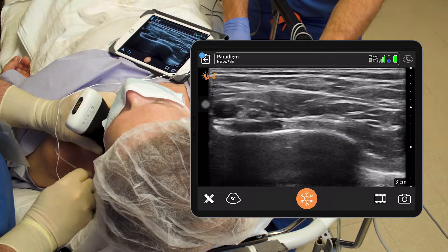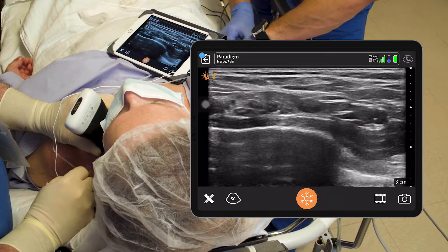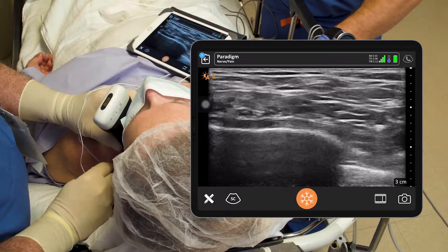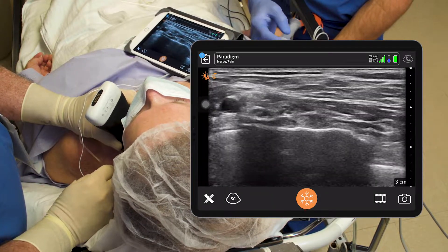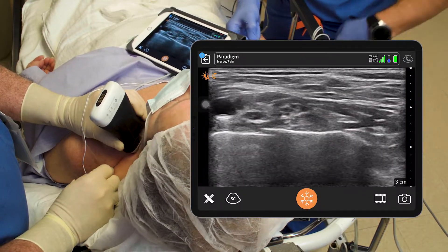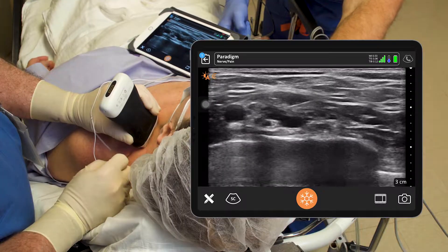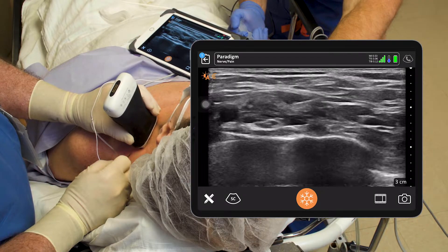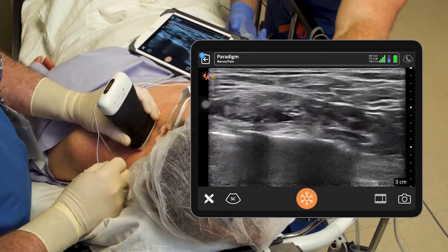We're going to come back and come up here, see if we can get in a little further, closer to the artery. Actually, I might try to peel off the upper trunk a little bit. Rocky, give us five right here — we're good, trying to peel off the upper trunk. Aspiration. And another five right there — aspiration. I think we got between the middle and the lower trunks there.